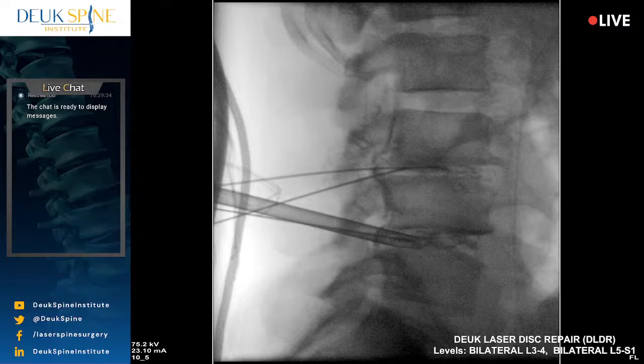I would say give him some Dilaudid then. Yeah. Sure. I'll leave it up to you. You're managing it, so I don't mind giving him some oral. Oral lasts longer. Scope on. But ultimately, whatever you feel comfortable with.